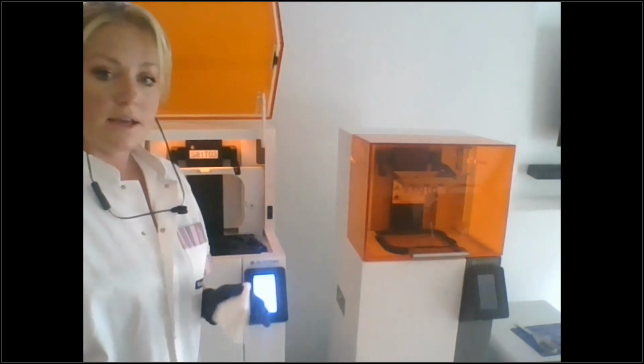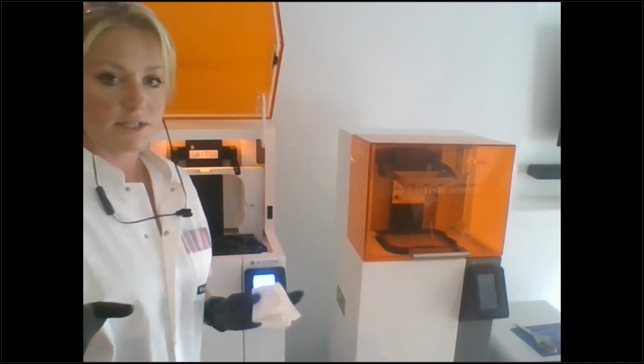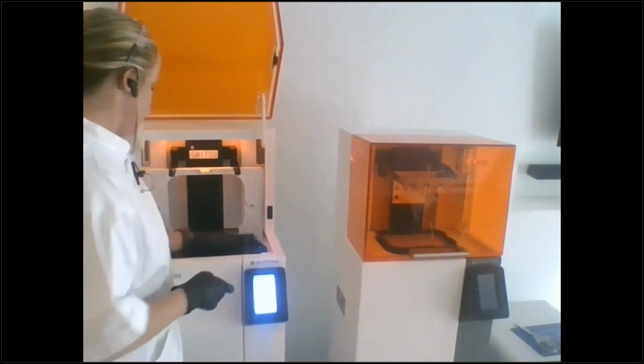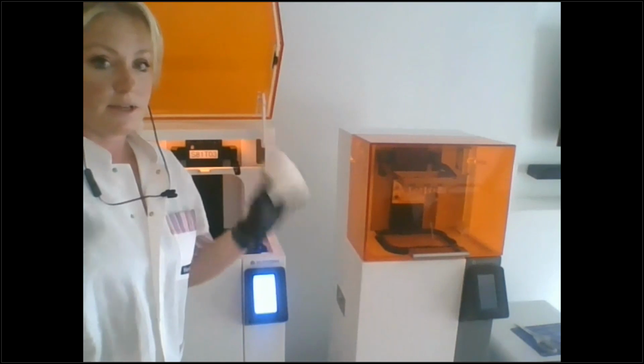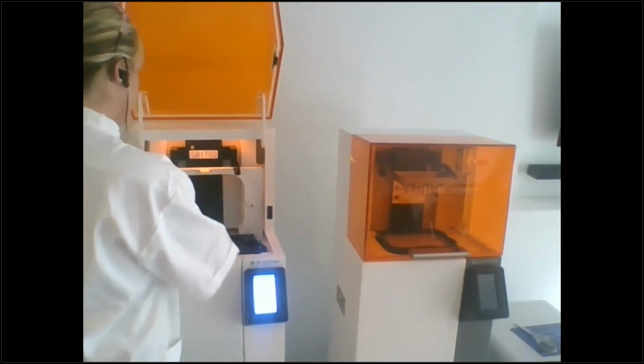We'll send you instructions. So this way you still have that smooth surface and you don't cause stress on your membrane, okay? So don't fear if you see a chip that you did by accident, maybe you dropped your build platform on it or somebody did something, it's easy to fix. You don't have to replace it, okay?